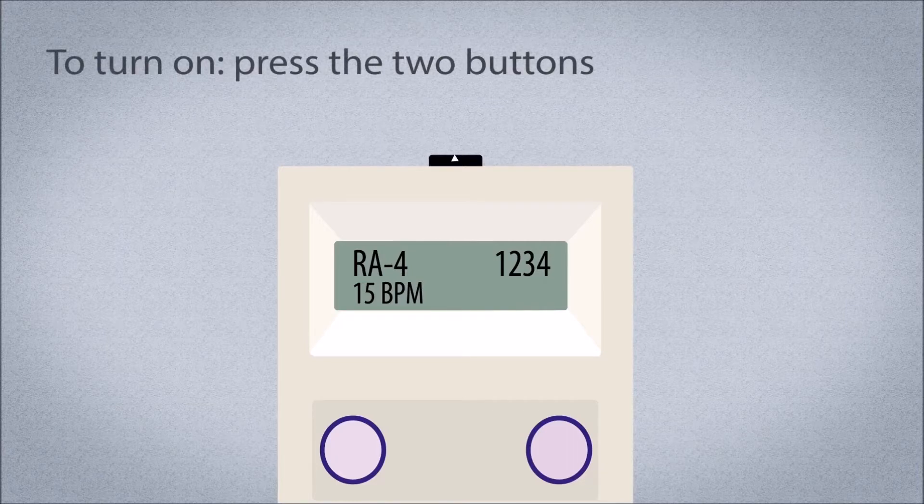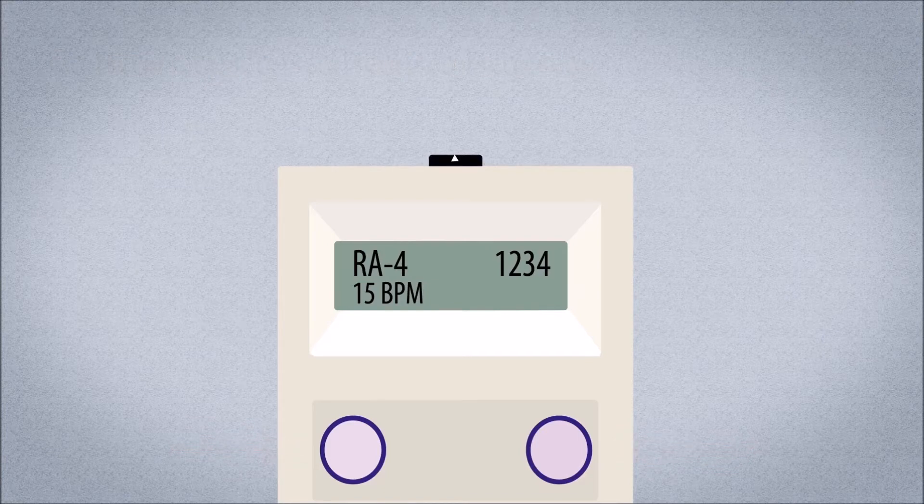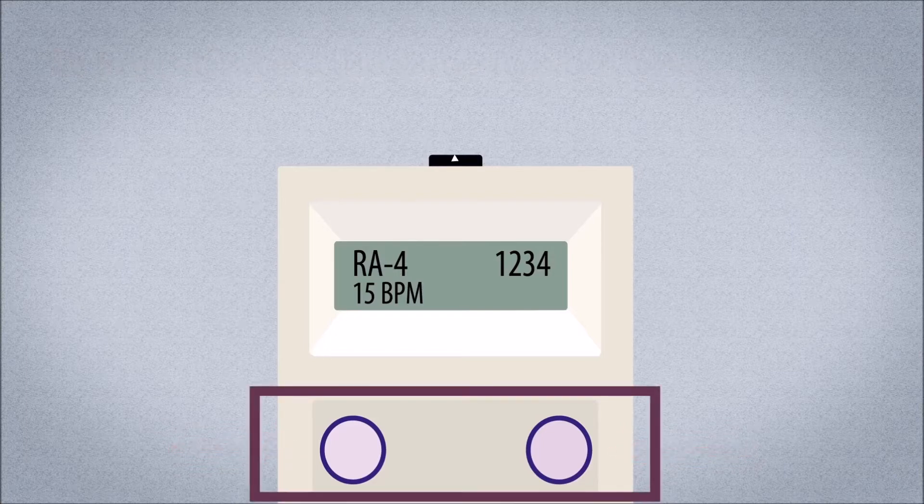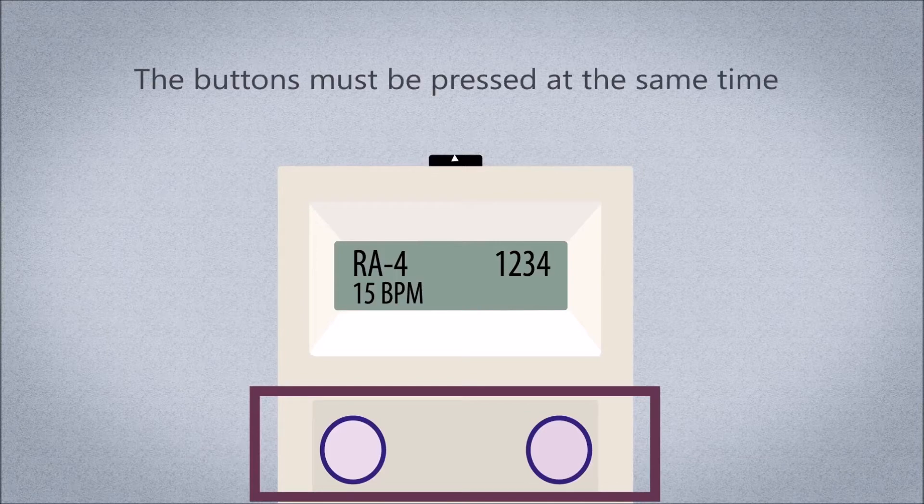To turn the NeuRx EPG on, press and release the two buttons on the front of the NeuRx EPG at the same time. To turn the NeuRx EPG off, press and release the two buttons on the front at the same time. The buttons must be pressed simultaneously — this is a safety feature to guard against accidentally turning the EPG on or off.